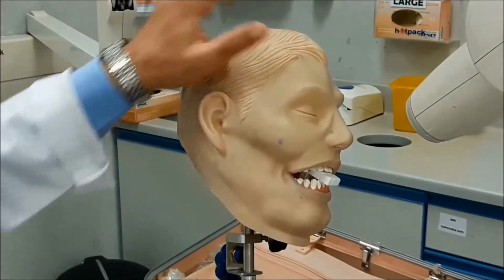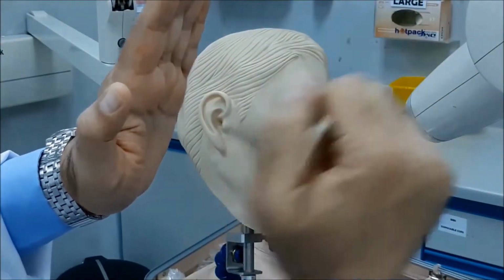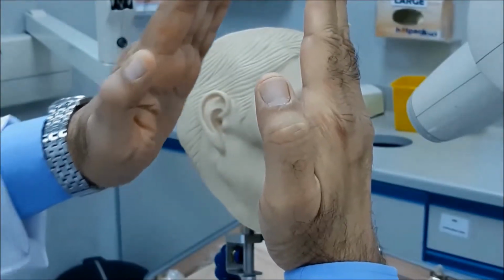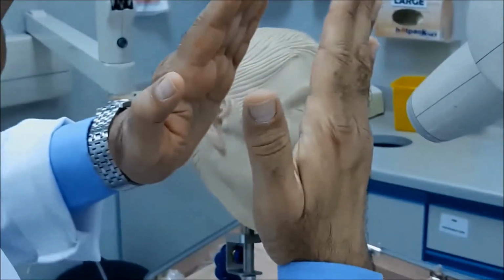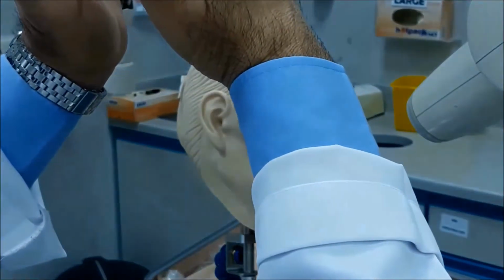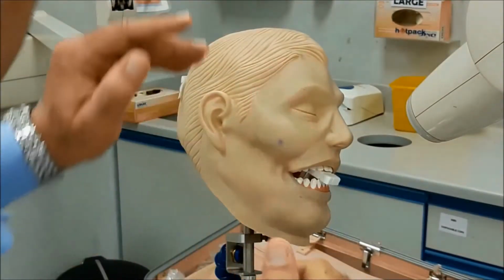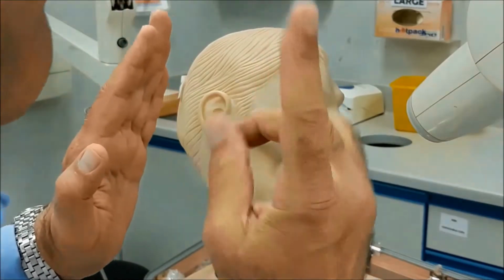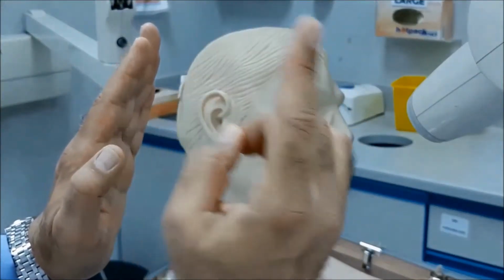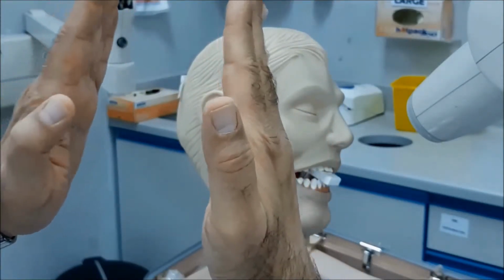malpositioning of the tooth and the film. So you have to compensate for this angle by directing the beam to the angle bisector between the tooth and the film. See, this is the tooth and this is the film over here. There is an angle, not like in the upper central incisors. You direct it perpendicular on the tooth. Here there is an angle. So you have to compensate for this and you will direct your beam not perpendicular to the tooth, not perpendicular to the film. You will direct it perpendicular to the bisector of the angle that has originated between the tooth and the film. Okay?